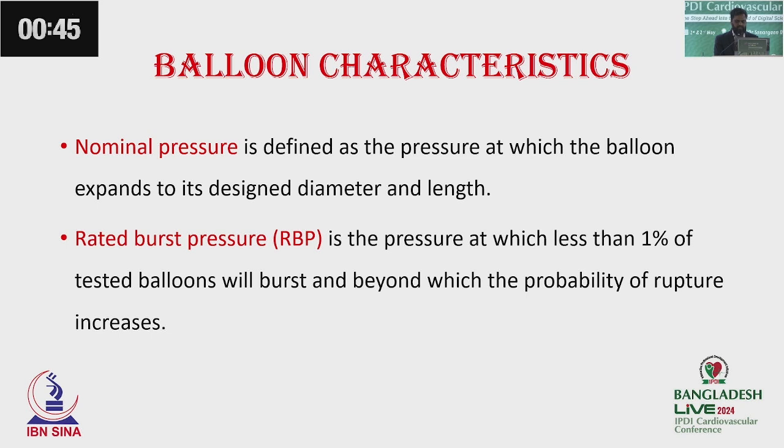So those who work in the cath lab know these two terms, that is nominal pressure and rated burst pressure.